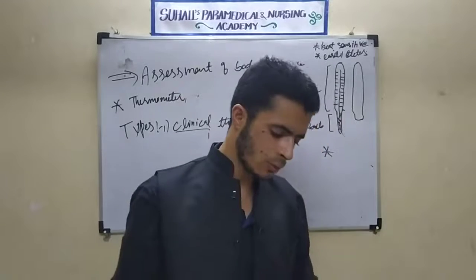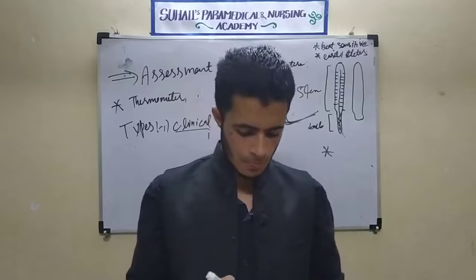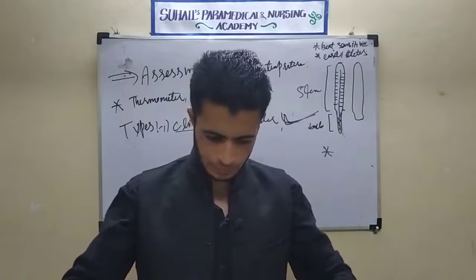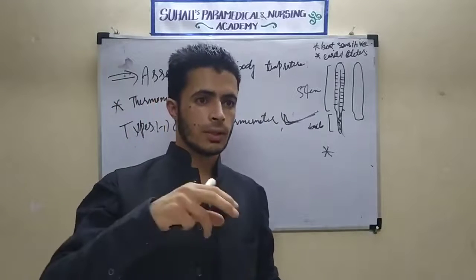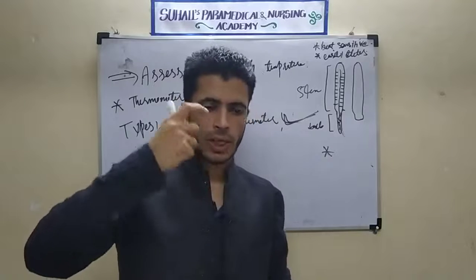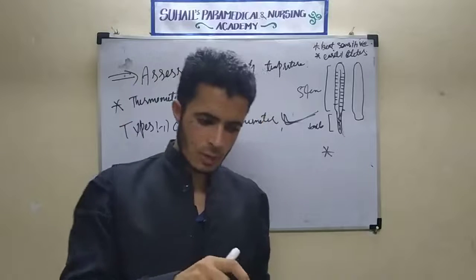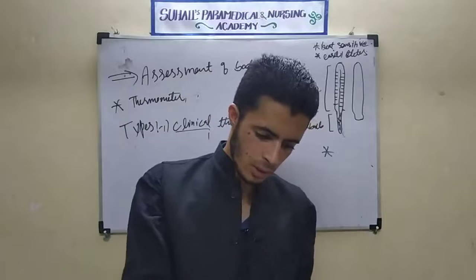When there is presence of mercury, we have to take the sheet. But before taking the sheet, when there are drops of mercury, don't use hand, don't use anything. First we have to take an eardropper, which provides drops in the ear, or an eye dropper. We will use the eardropper to take these drops.